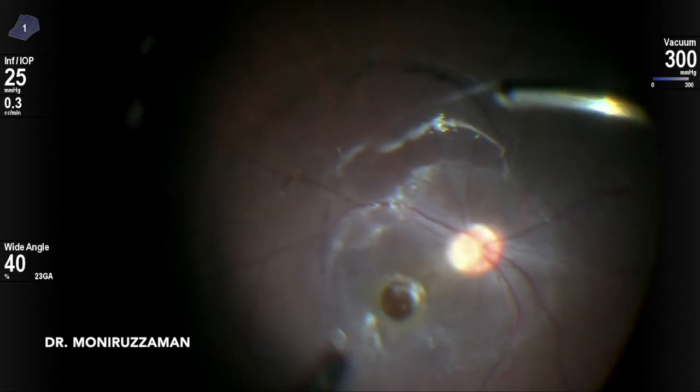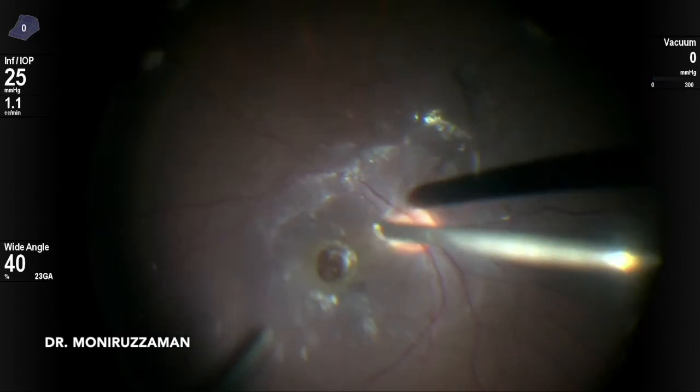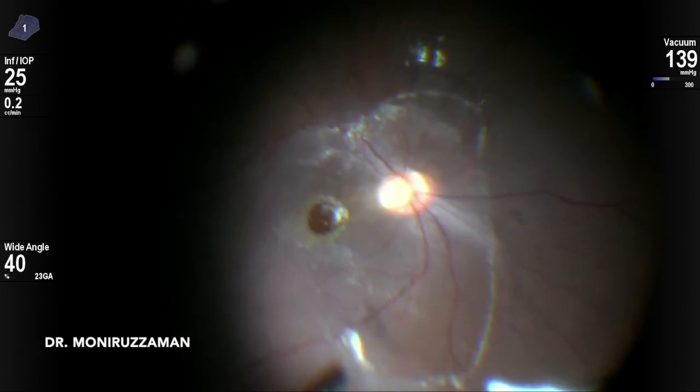Traumatic macular hole may present in different ways. In this case of large traumatic macular hole, PVD happened leaving a central part behind. Trauma sometimes causes firm adhesion between the posterior vitreous, ILM, and retinal layers.